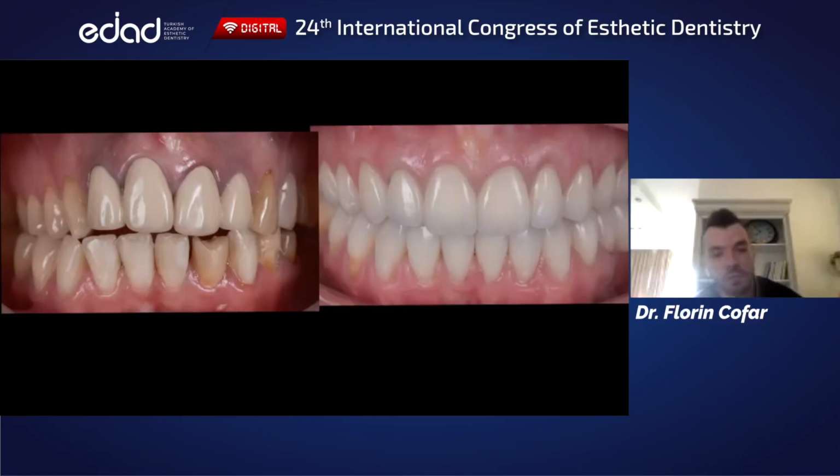Sometimes you'll use it, most of the time you'll use it, sometimes you'll opt for something else, but it should be in your pocket anytime, because it's what gives you that 85% streamline in cases like this. It takes away the stress of many things, and you can focus on details. Also, as you can see here, the efficiency and the speed of cases is completely different, because in both examples you can see the prep and the crown lengthening surgery are in the same session, and the graft and the bonding are usually in the second session after the lab.